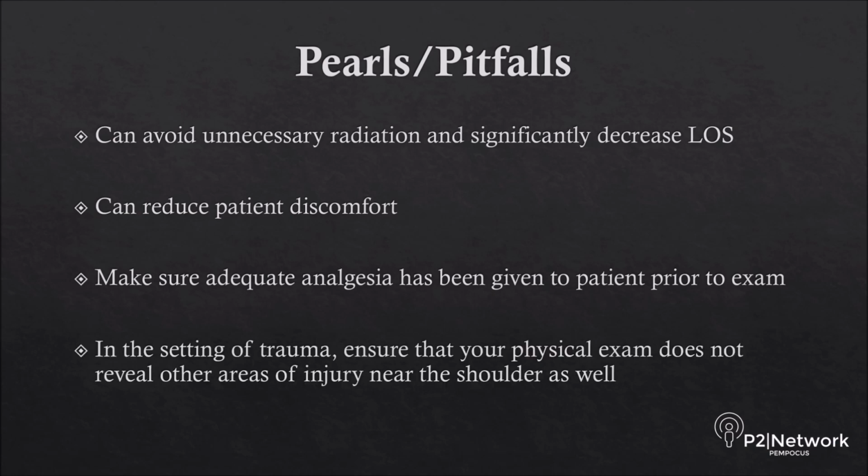Also, in the setting of trauma, ensure that your physical exam does not reveal other areas of injury near the shoulder as well, including but not limited to the clavicle and chest wall before focusing on the shoulder with your POCUS exam.